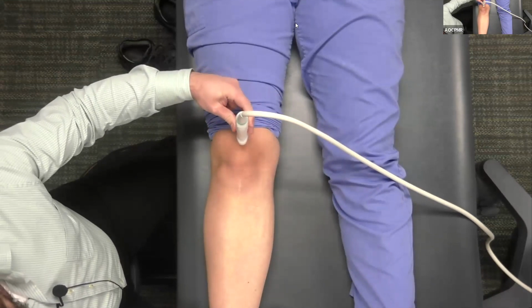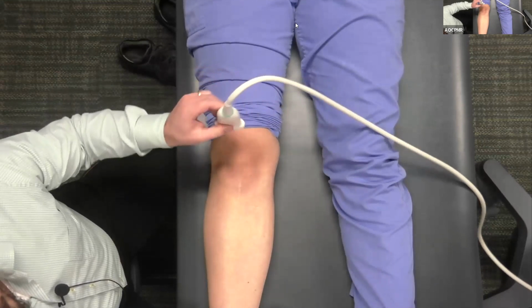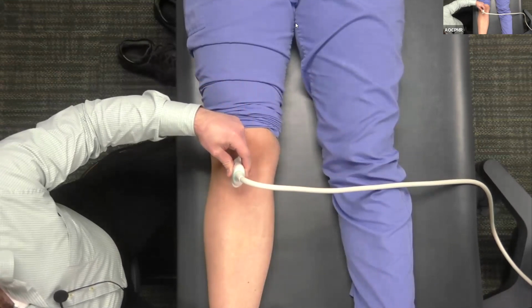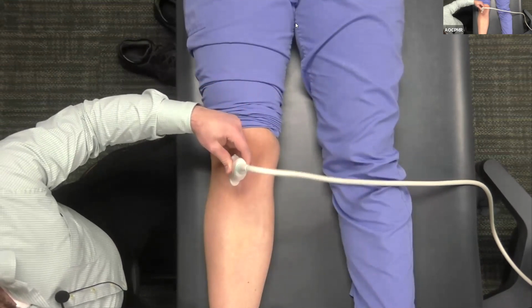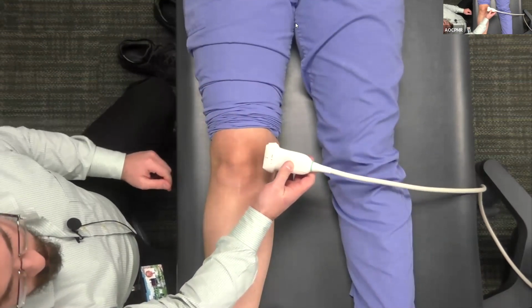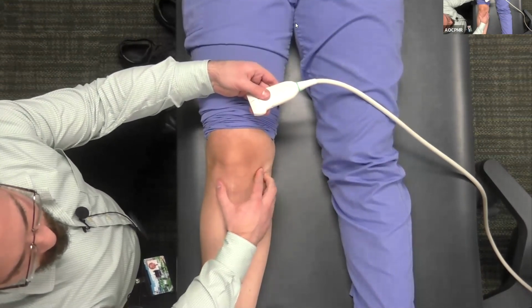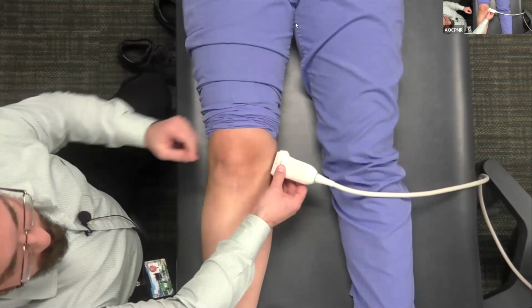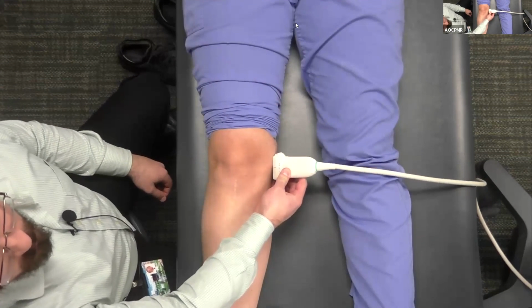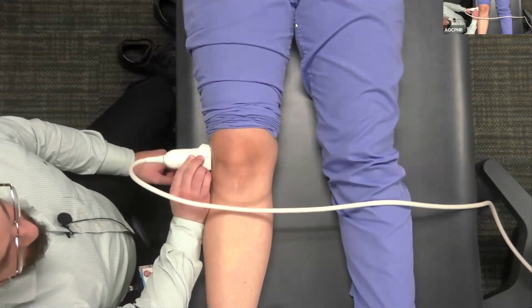When we're evaluating the quadriceps tendon in that anterior view, this is long axis, this is short axis, same thing. We're going to come down over the patella. Infrapatellar is going to be over here. Then when we're looking at the medial knee, we're looking right here at the joint line. You can, of course, palpate using your hands all the way down to find where that joint line is. You just place the probe right along that joint line. You're seeing the top of the meniscus crossing over, and it's going to come around to the pes anserinus. And for the lateral knee, you're going to go this way.